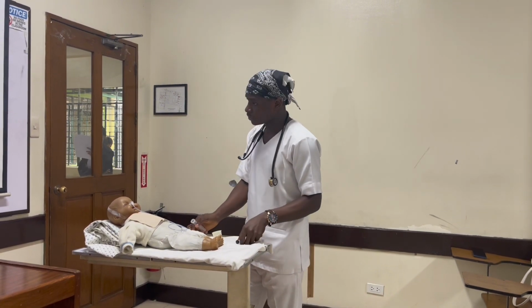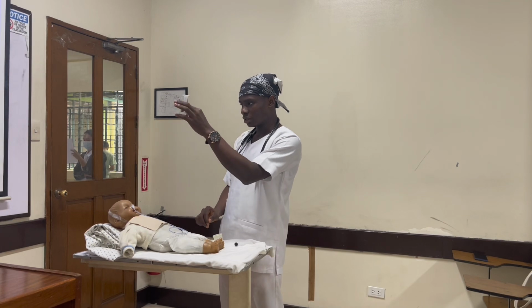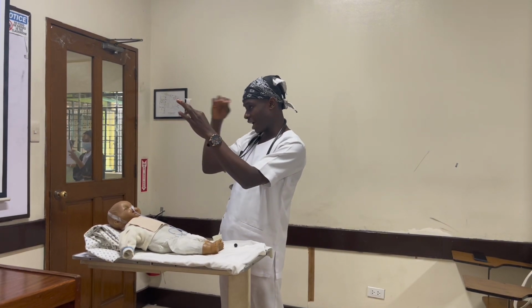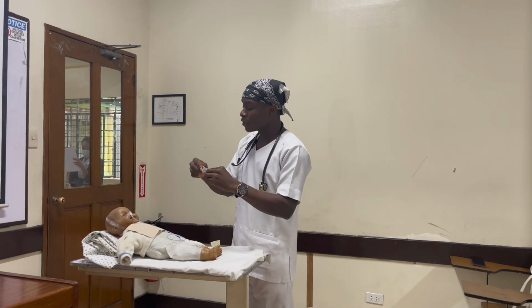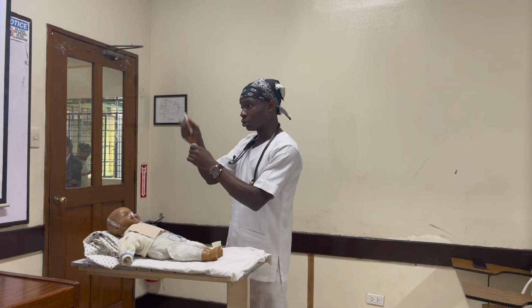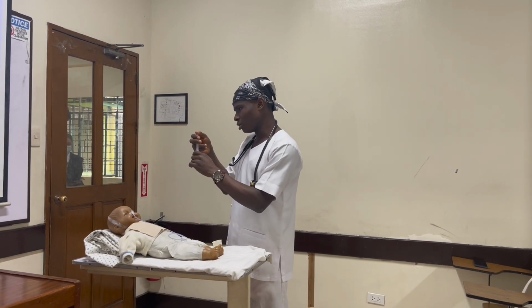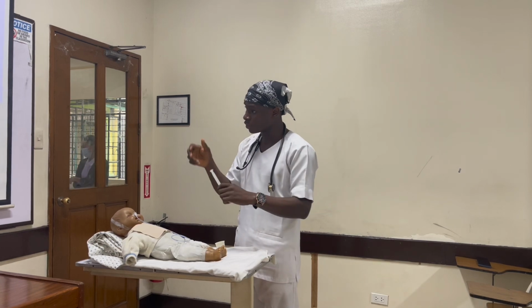While doing all of this, and also while feeding, just as I said, the syringe should be at eye level, just as I did. If the feeding happens to be difficult, then I use the plunger, but only a little push, not a heavy push. Don't force it.